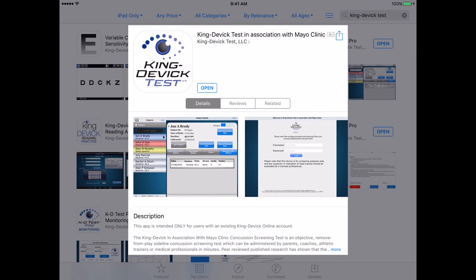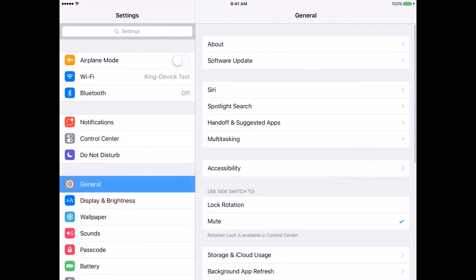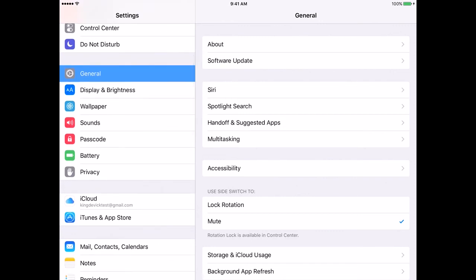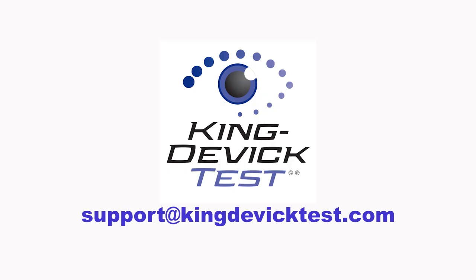To ensure you're always running the latest version of the app on your iPad, tap the Settings icon, then tap iTunes and App Store from the left column. Be sure Updates is turned on, indicated by green. For further questions or assistance, contact us by email at support@kingdevicktest.com.